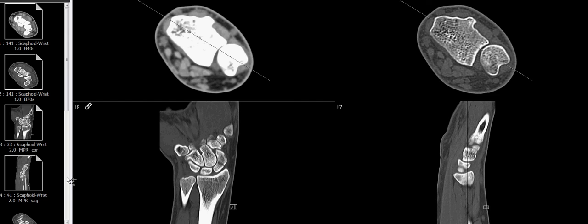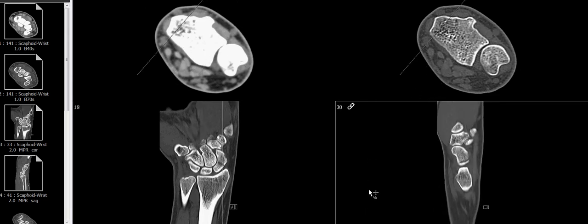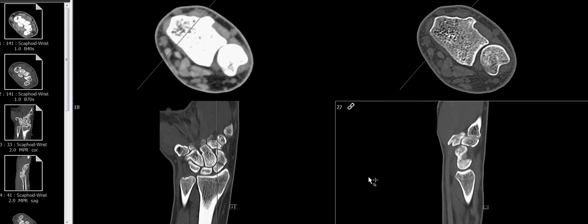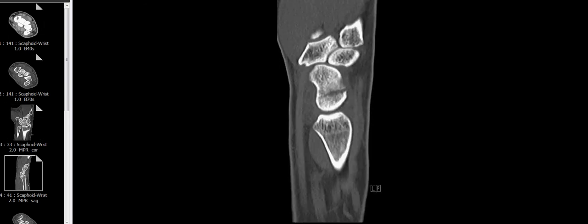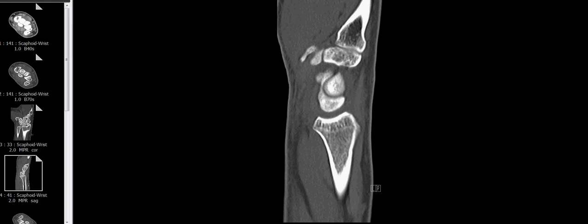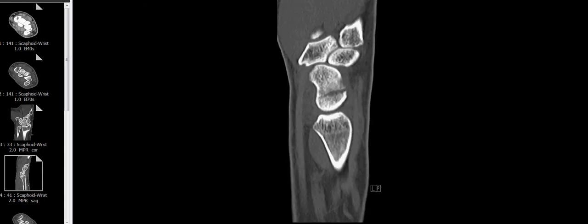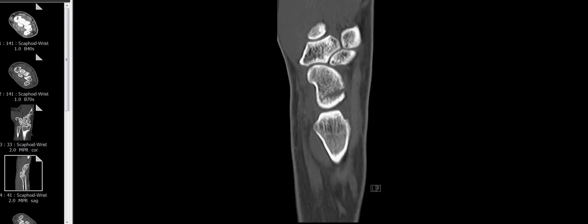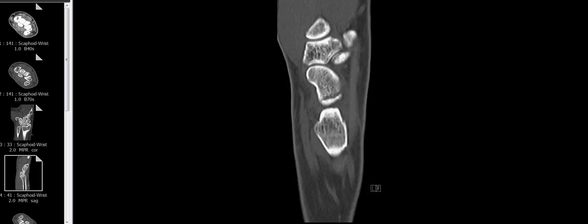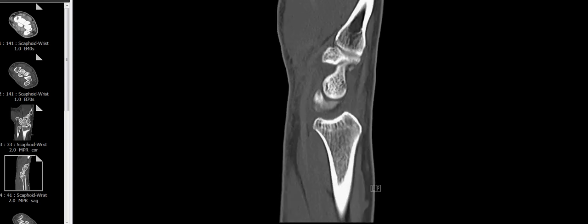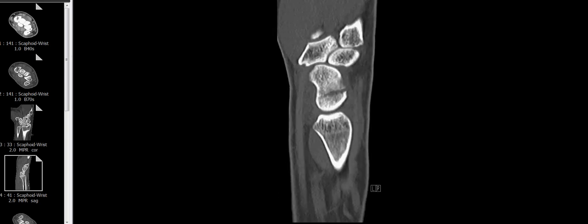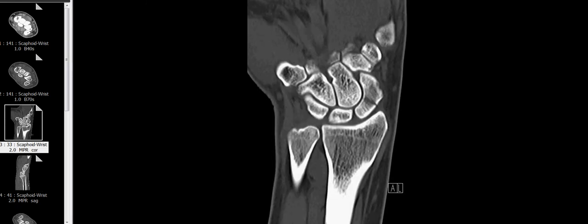These are the conventional images in the normal orientation. These are the sagittal images. You can see that the scaphoid bone starts here, here's the fracture, and you can see the head out here — it's seen on multiple slices.